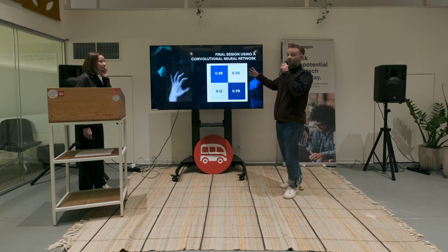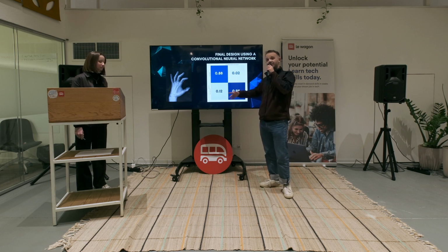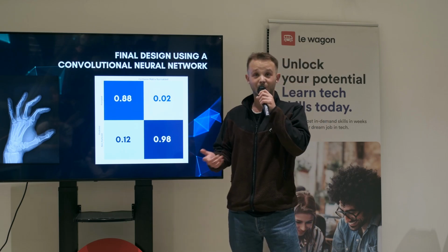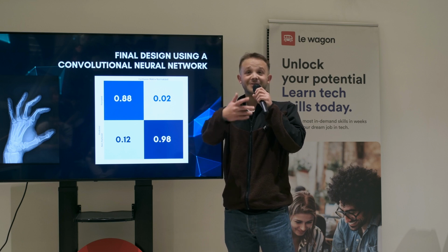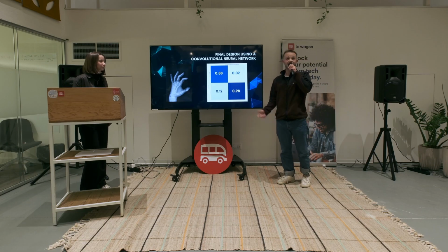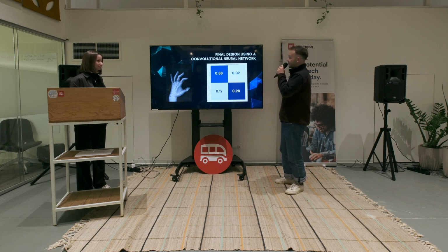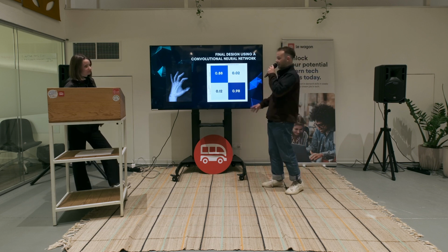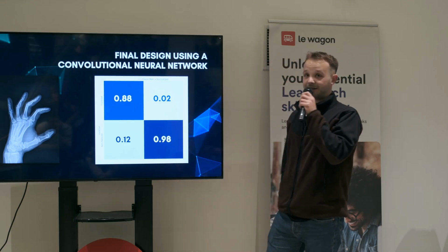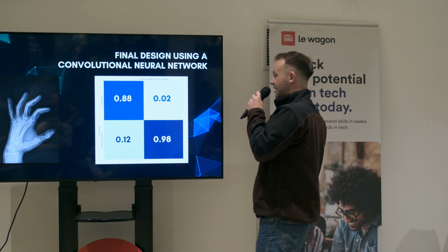And this is especially interesting because our data was extremely unbalanced. We had many more X-rays without a fracture than X-rays with a fracture. So it would have been much more worthwhile for the model to just say, oh, it's not a fracture, everywhere. That's a problem we came across a lot during our project. But in the end we got a total accuracy, combined with the unbalancedness of the data set, of 96%, which is quite good, I would say, in the industry.